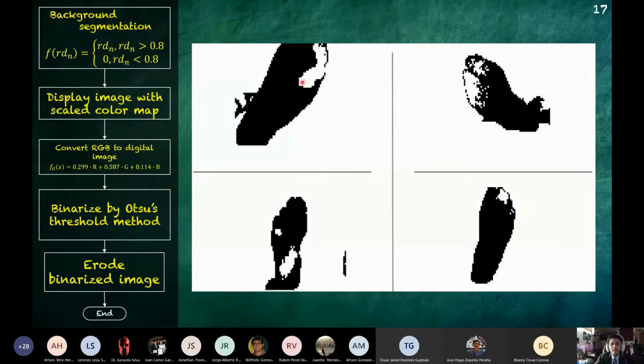We can find that it is possible to display some regions in terms of temperature intensity. However, in terms of computational methodology, if we want to, for example, detect how many regions exist in the sole of the foot, unfortunately, we will detect several regions because every scattered pixel will be interpreted as a single area.